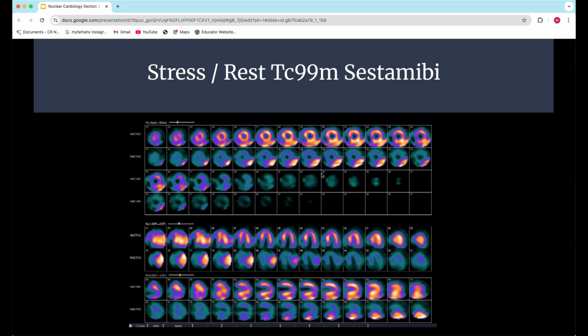And so I would say just throw them under there and take a look before you actually turn on your camera. And oftentimes you can get a good look as to whether you have separation and whether the image is going to be okay. And hey, if it looks like there's not a bunch of gut uptake, image. That works. Go ahead and image. Because why wait when you're getting good images?